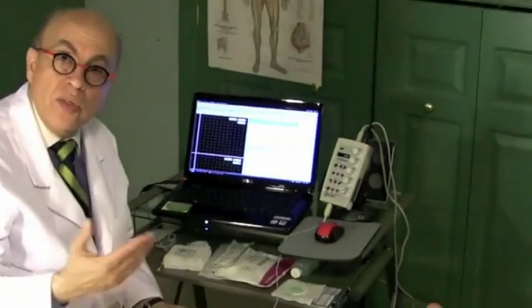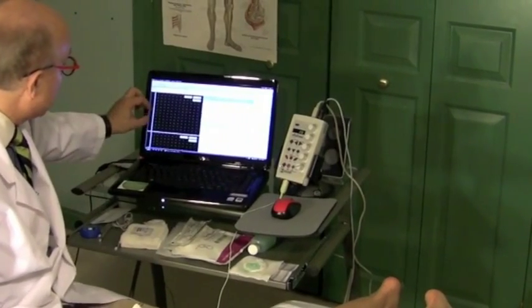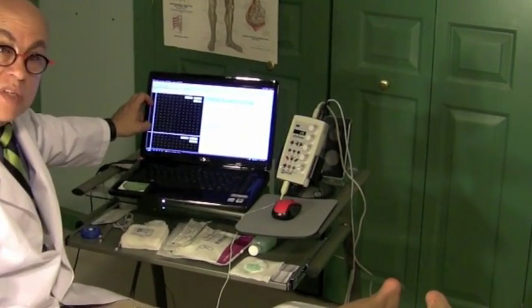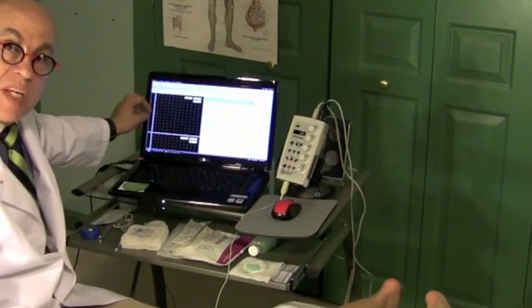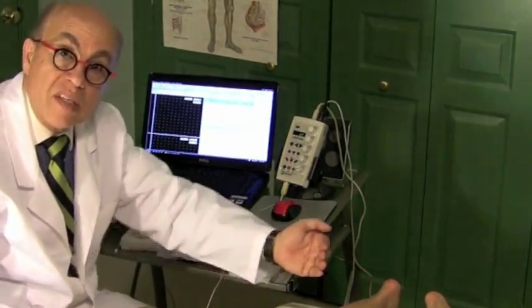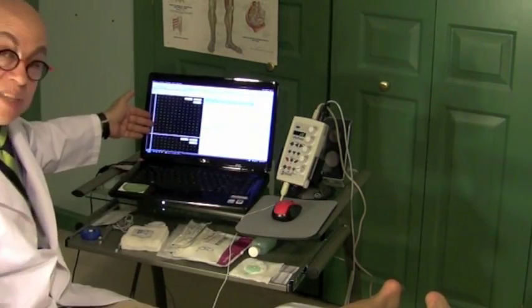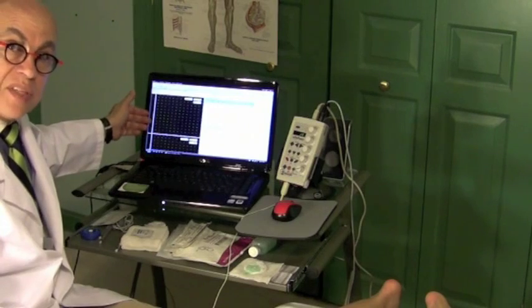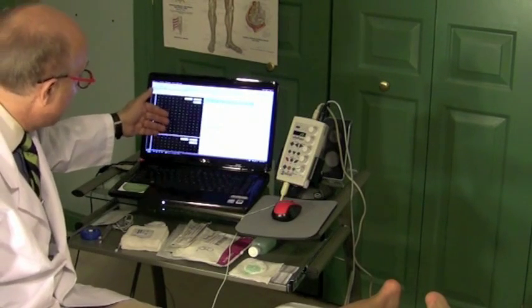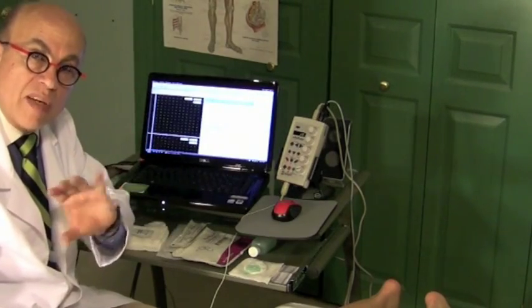Now I have to tell you, with the M wave, with the F wave, you see a very, very nice motor response here. With the H reflex, you want to see a smaller one. The reason you want to see a smaller one is because you really want to study the sensory fibers first. So I'm trying not to get as good a response, believe it or not, on this side. I'm trying to get a great response on this side first. That's the difference between the H reflex and the F wave.